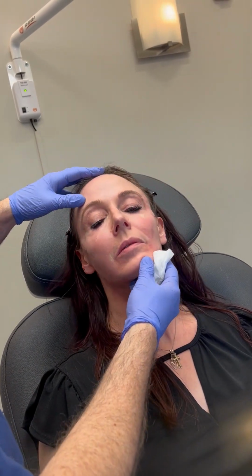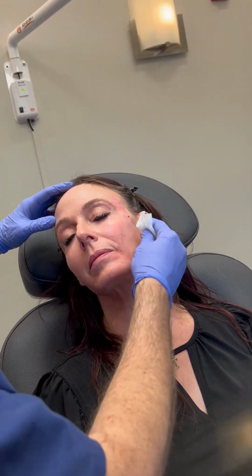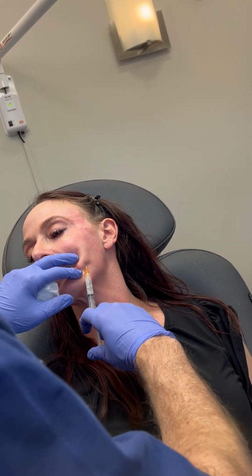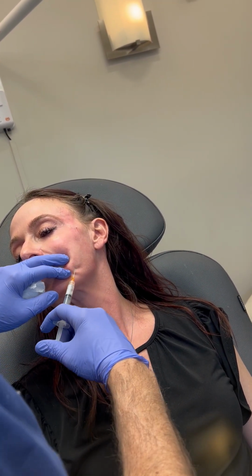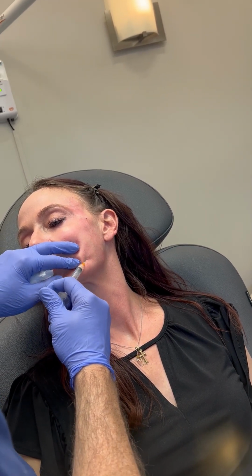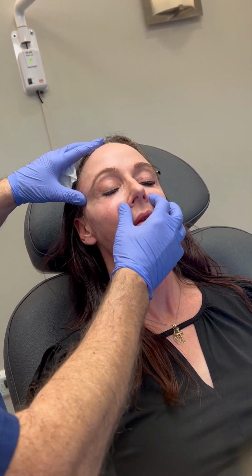And then we're going to turn her this way, and for this side I like to have the patient face me so I can reach across the face, and then push this into the buccal zone, 2.5 cc's. Okay, we should have a little bit left, so we're going to do a little bit in the nasolabial areas.